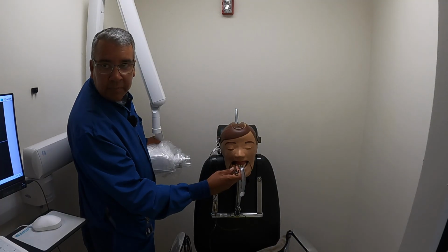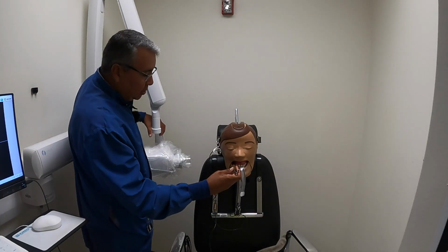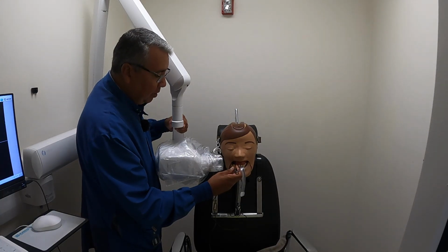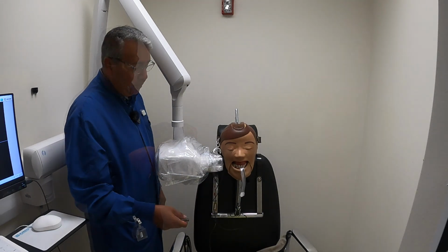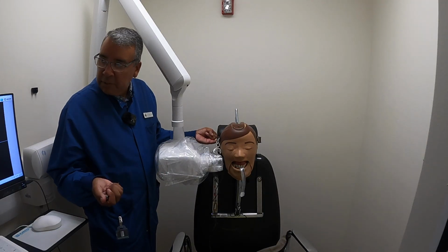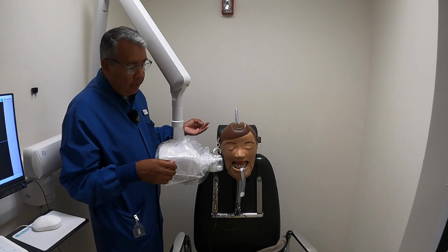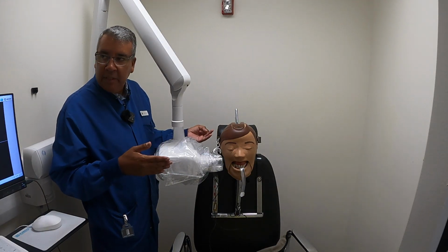Our horizontal angle is based off of the horizontal angle of the teeth that we are trying to take. So now I'm going to take this PID, rotate it to where the face of this is now parallel with those teeth, and I've just found out my horizontal angle. There's one thing left. When I put this on here, I did my vertical, you guys helped me with the horizontal. What's left? Cover the film, or the sensor, right? Cover the sensor.